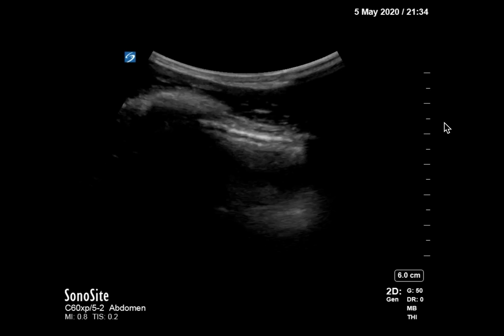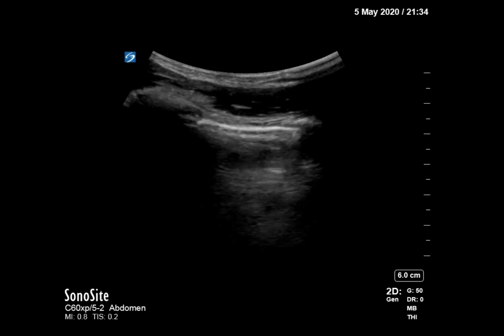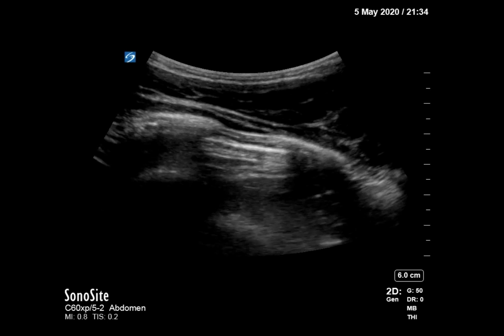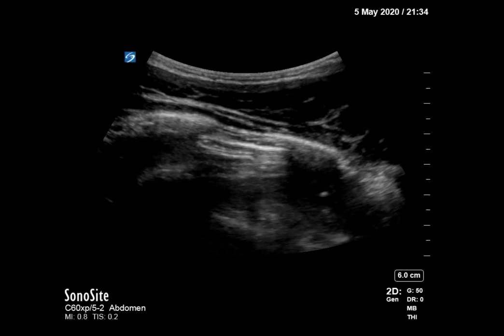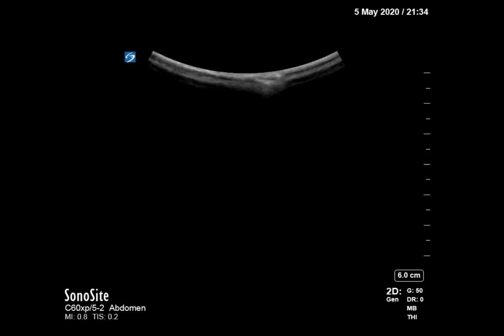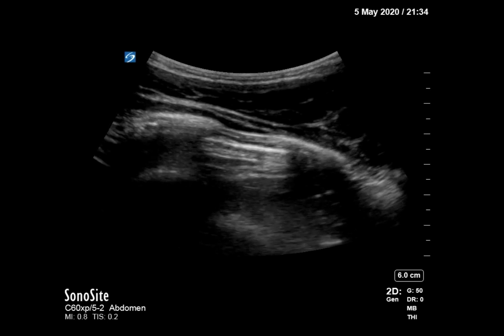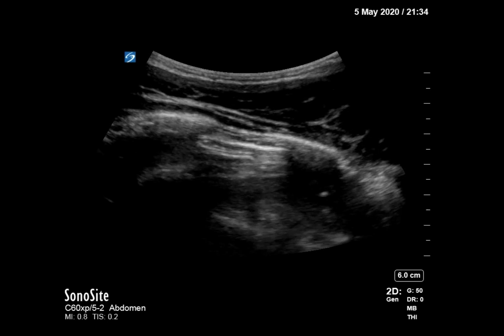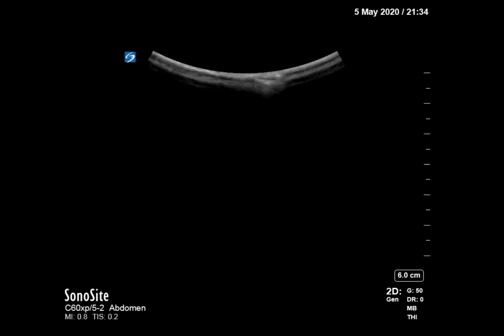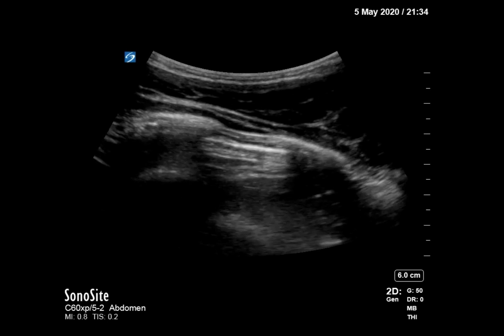It's always good to compare to the asymptomatic side, and then go back to the symptomatic side where we can see there is no lung sliding. So we did diagnose a pneumothorax in this patient who had fallen approximately 20 feet out of a tree, who had an otherwise negative FAST exam, and he ended up getting a chest tube.